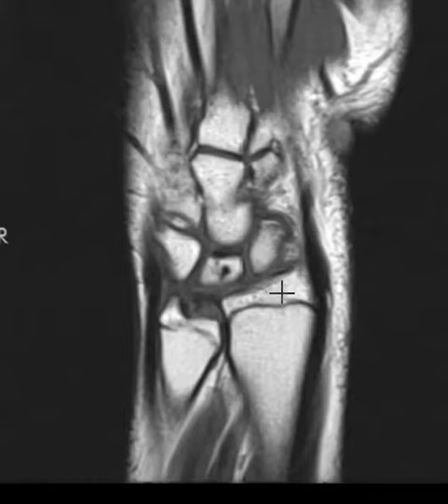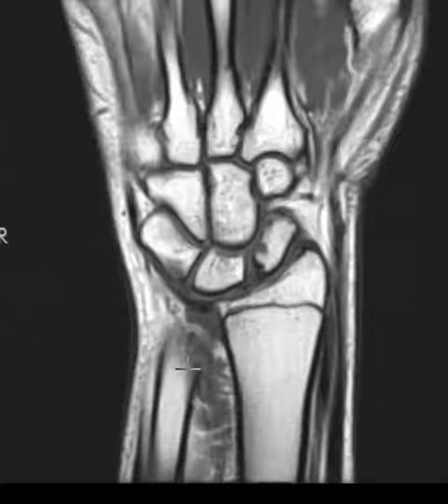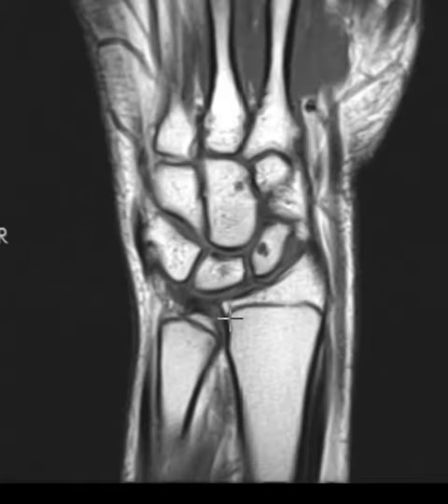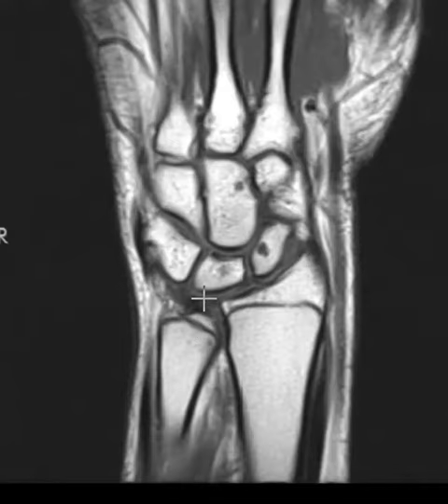But we see some other things here. We see the radius, this bone here, the forearm — it ends here — and this is the ulna. The ulna is a little bit shorter than the radius. Normally, the ulna will go a little more distal; they're almost the same length. The ulna is a little bit shorter, but this is what we call a negative ulnar variance. Sometimes it's too long and will press into this part of the wrist — we call that a positive ulnar variance — but this one is a little bit short.